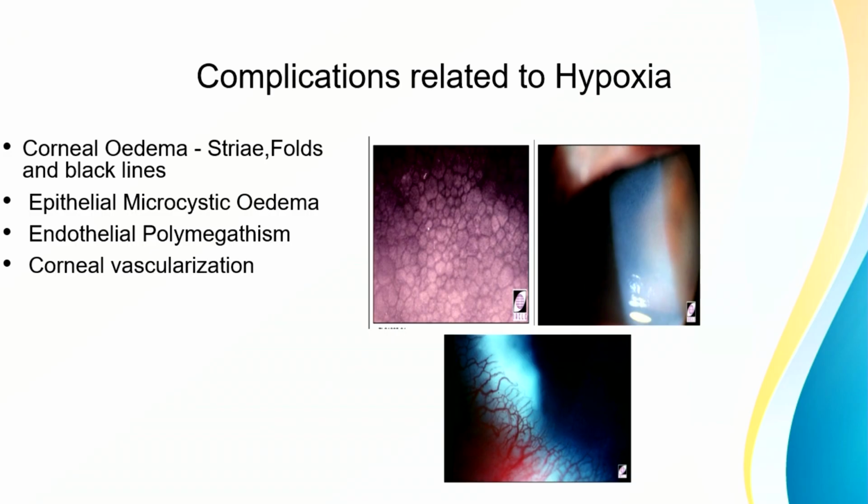Second thing, if the patient is using yearly disposables, I have seen many patients who are having -2, -3 power still using yearly disposables. For them, monthlies or bi-weeklies will be a better option than yearly disposables. We can shift like that. Or daily disposables in case of heavy corneal edema, in someone who is using lenses for more than 14, 16 hours, daily disposables will be a better option again.